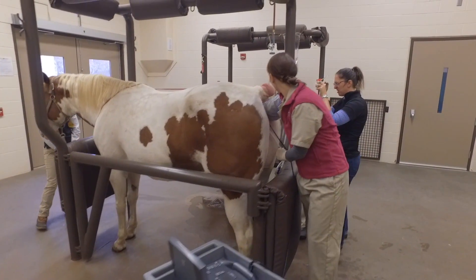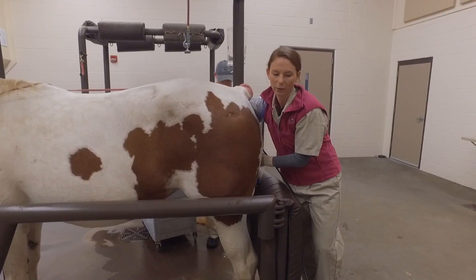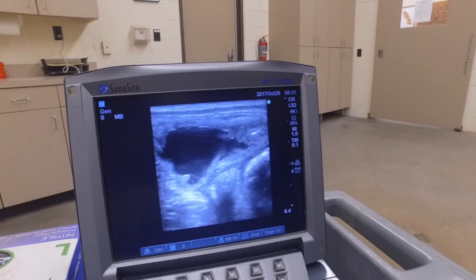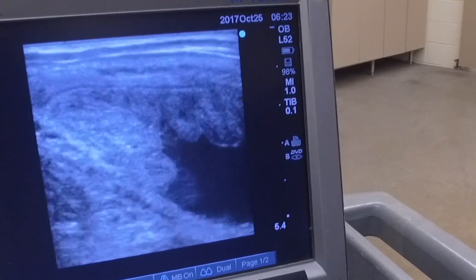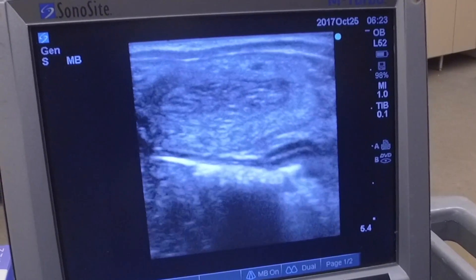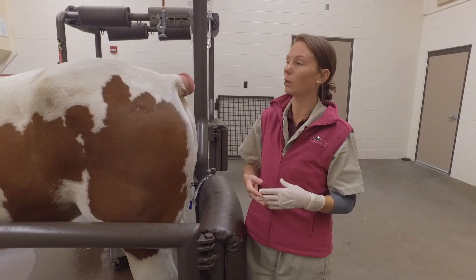So we can go ahead and open up our filter and siphon all this fluid out. I'll stay in here just to make sure that we get all the fluid siphoned out of the uterus. While I'm in here I can also manipulate the uterus to push the fluid towards the internal os of the cervix so that it comes out through our Bovona catheter. We still have fluid in the body, but moving up into the horns you can see there's none of that black fluid in the central portion of that uterine horn. We've gotten most of the fluid out, but we'll go ahead and give her some oxytocin to help contract that uterus so that the last bit of fluid can come out as well.